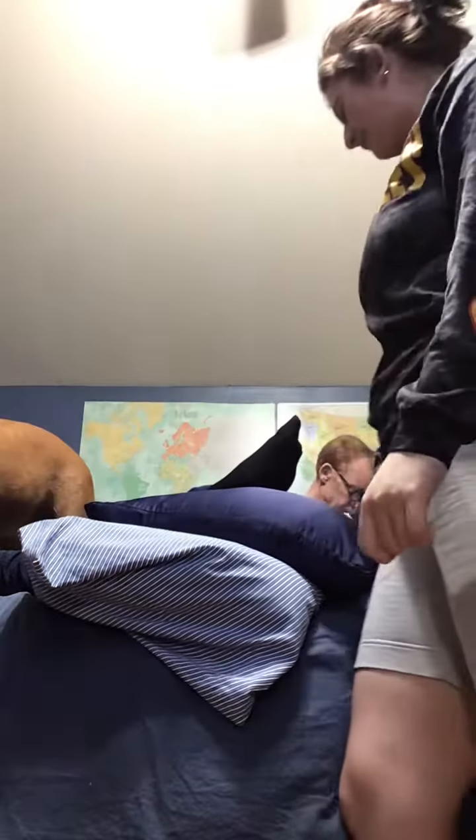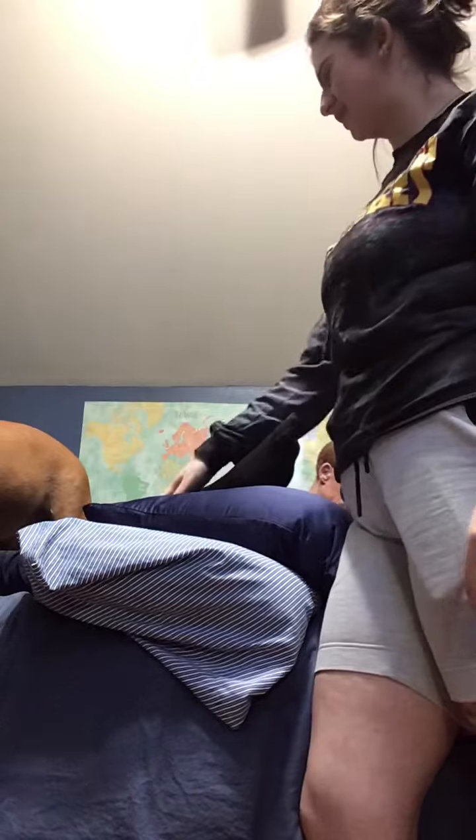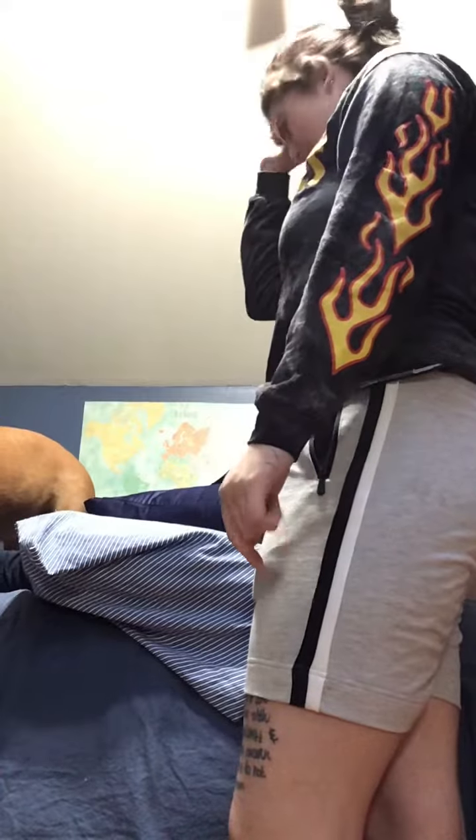I'm gonna make sure her socks are comfortable. Are they comfortable? Do you need the bed raised? Do you want the pillow adjusted? Okay, and that's my stocking application for residency.